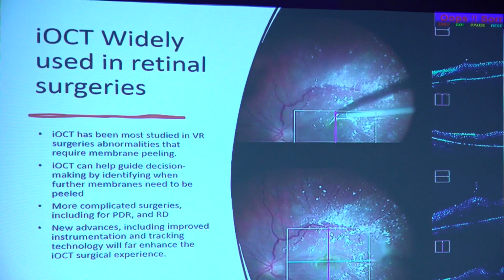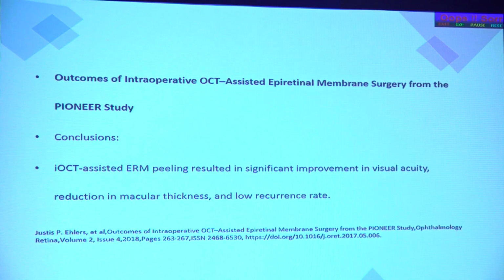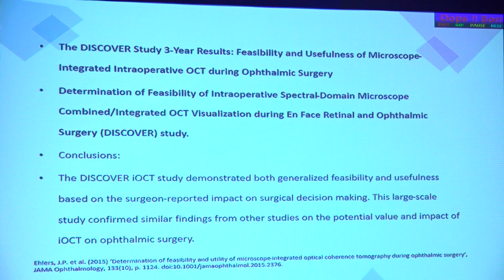Intraoperative OCT has found tremendous use in retinal surgeries. This is where most of the benefit will be gained by VR surgeons, so that it can help guide decisions when they're performing surgeries for PDR, RD, or even membrane peeling. This is a pioneer study which says that when surgeons used intraoperative OCT for ERM peeling, there was an improvement in visual acuity, reduction in macular thickness, and lower recurrence rate because they're able to do it much more meticulously and with better accuracy.